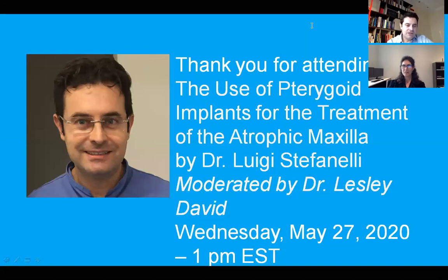You have to think that the greater palatine artery is quite parallel to the pterygoid implant. So it is very difficult to cut the descending palatine artery because it's parallel to the pterygoid implant. So I didn't report any severe bleeding.